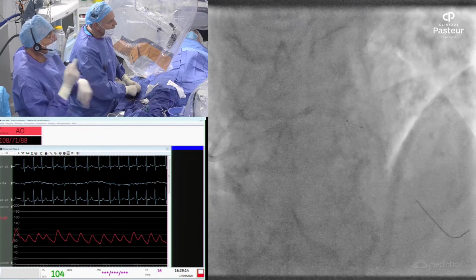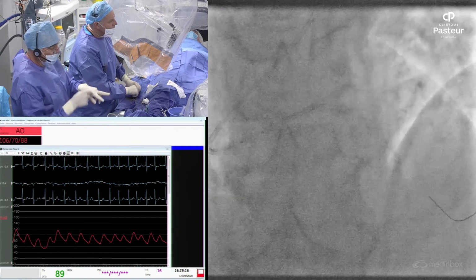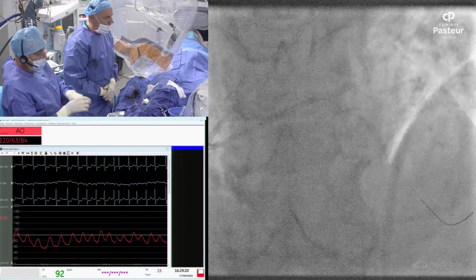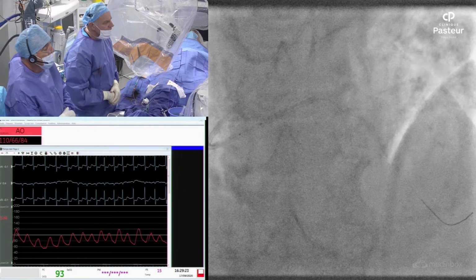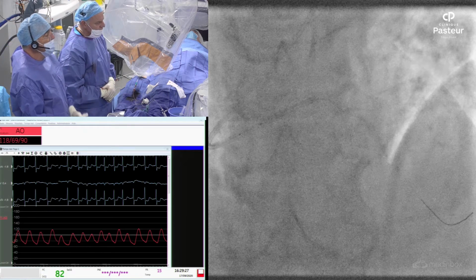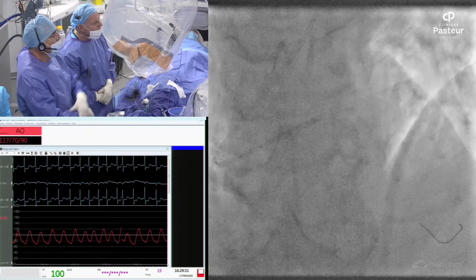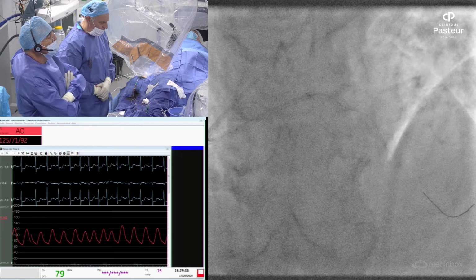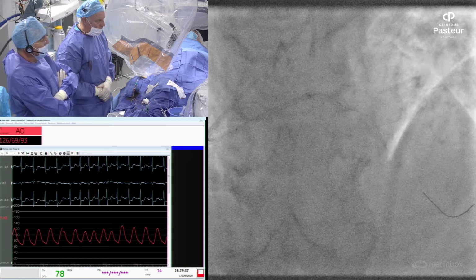It's totally different when we have a bifurcation with a long lesion on the side branch at the ostium, of 1 or 2 millimeters. In this case, we know that the balloon could not do the job correctly, so we do a quick opening of the side branch and then we move to the TAP very quickly, very fast. Okay, maybe we can check.